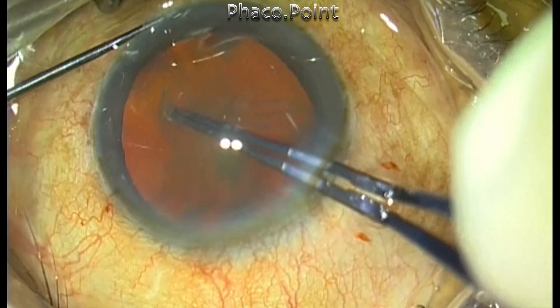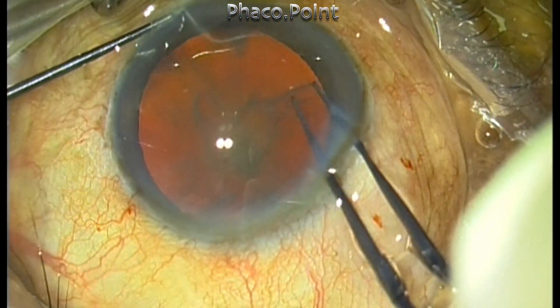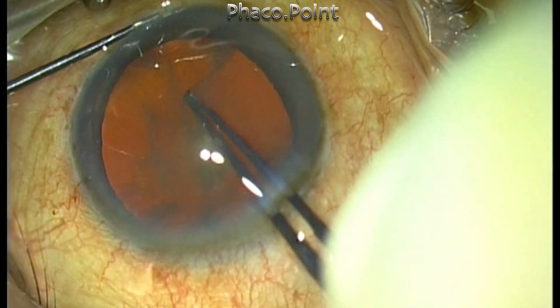With the help of a Utrata forceps, I have created the adequate size capsulorhexis, which I'm happy with.